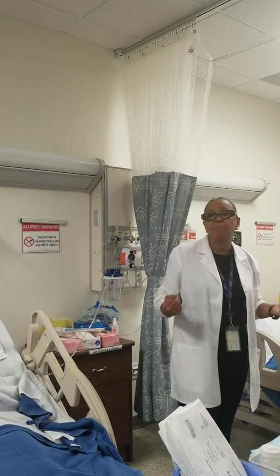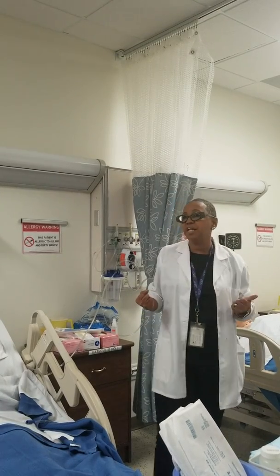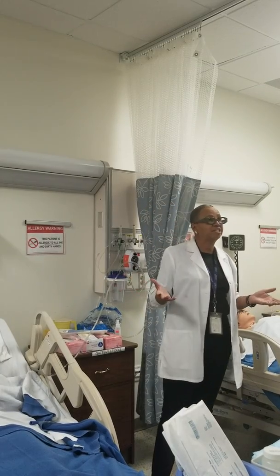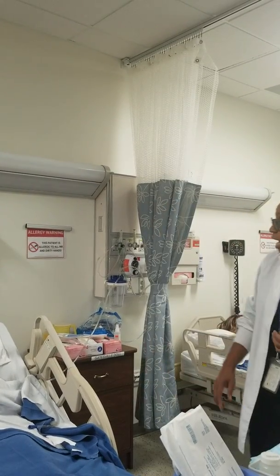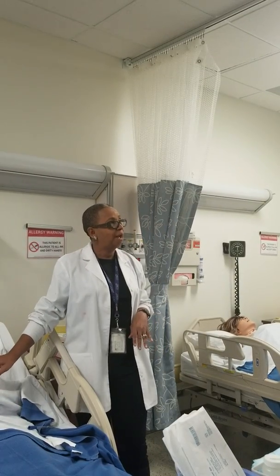I'm checking to see how much oxygen he is on. Okay? If he's on a ventilator, then that means that he's getting full support from his ventilator. How much oxygen is this person on? That tells me how long I can possibly disconnect him from the oxygen to do this. If I walk up and he's not on any oxygen, that's good. Let me check his pulse ox, let me check his work of breathing. I may be able to get through this.